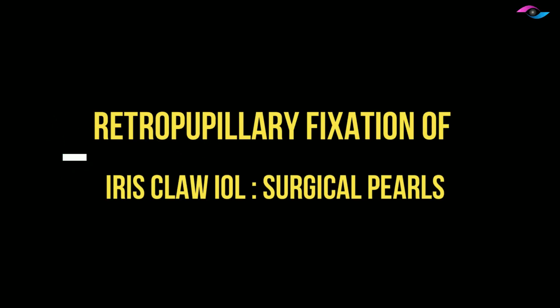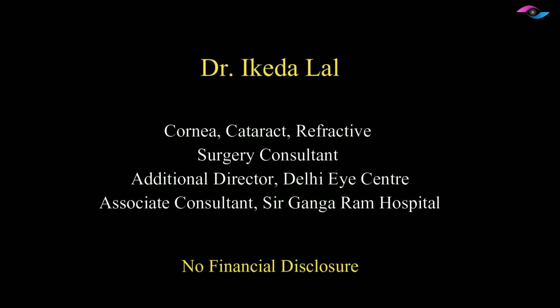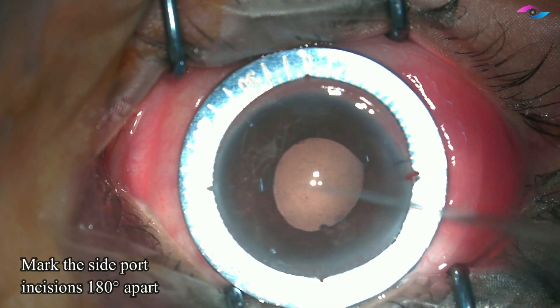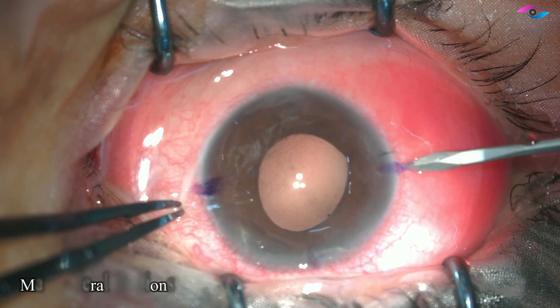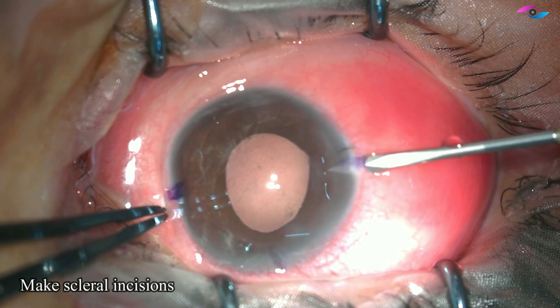Hello friends, today we will talk about the technique of retropupillary fixation of iris claw IOL. Iris claw IOL is a very useful technique to learn and we can specially use it in patients who are aphakic, or patients who do not have adequate posterior capsular support, or in complicated cataract surgeries.